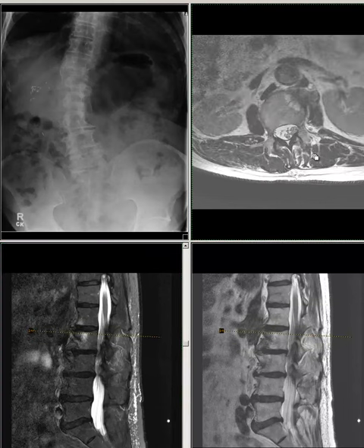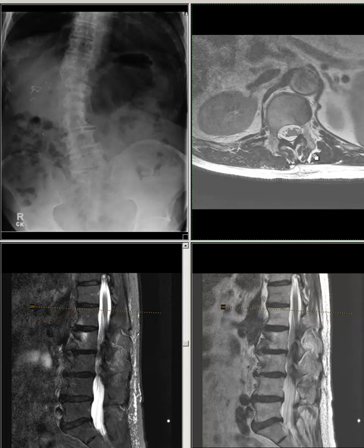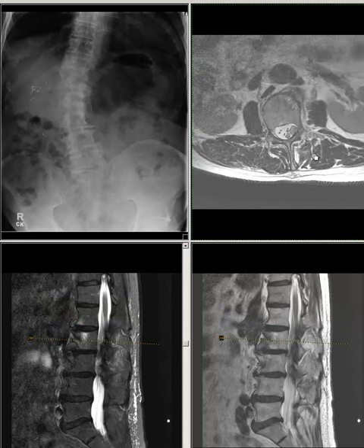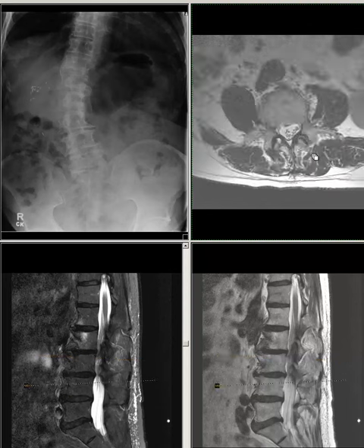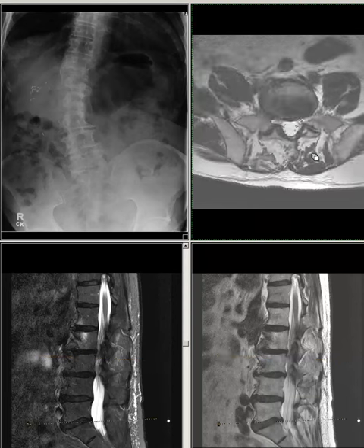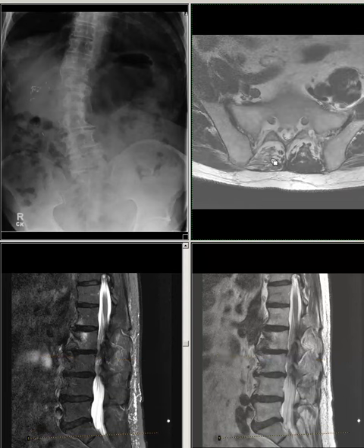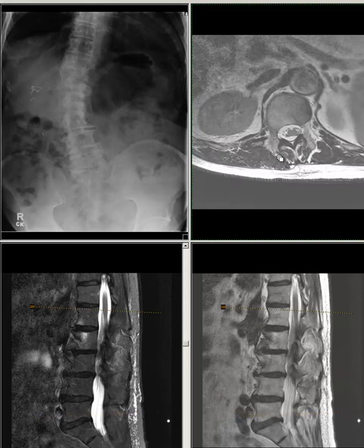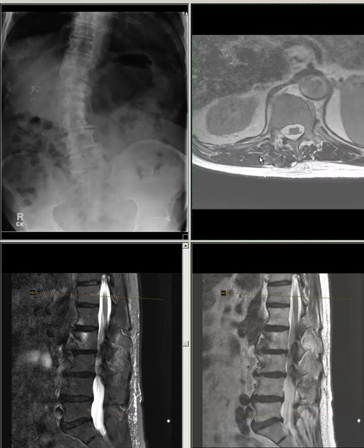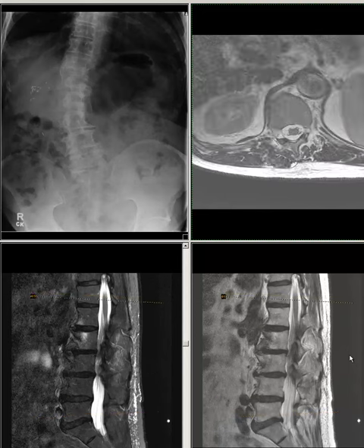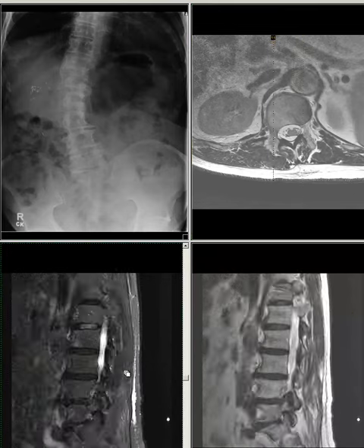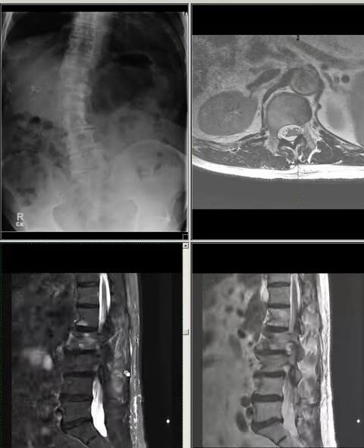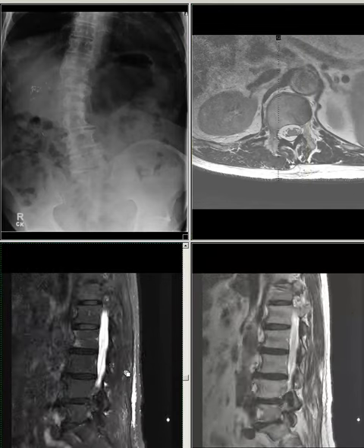Mild atrophy of the upper lumbar spine paraspinous muscle on the left side and fatty atrophy of the lower lumbar spine paraspinous muscle on the right side, due to scoliosis. No acute fracture, dislocation, or tumor process identified.